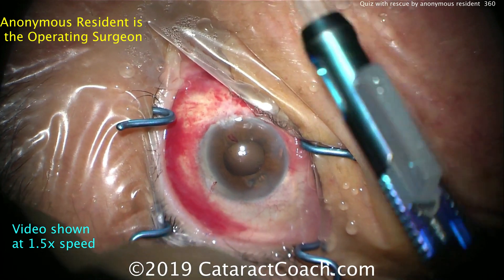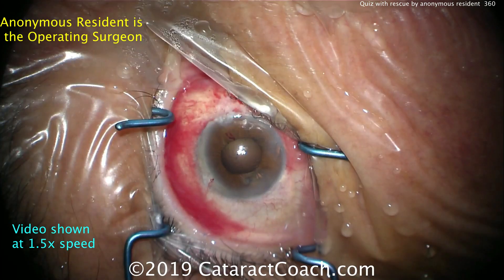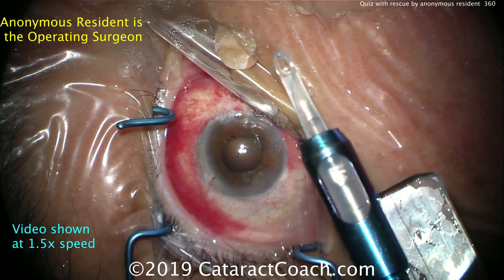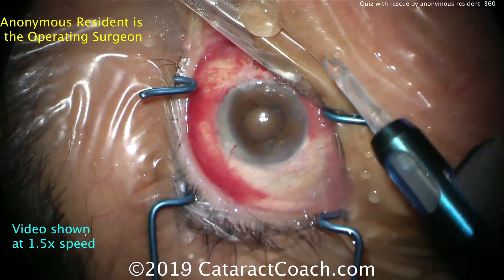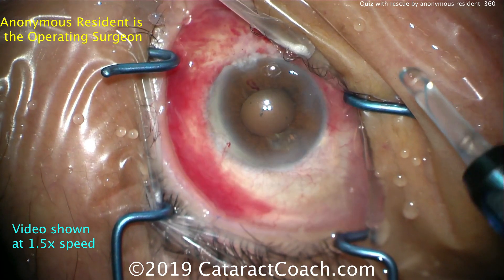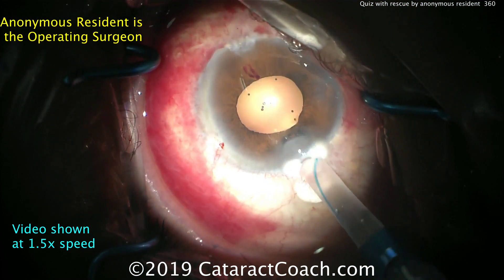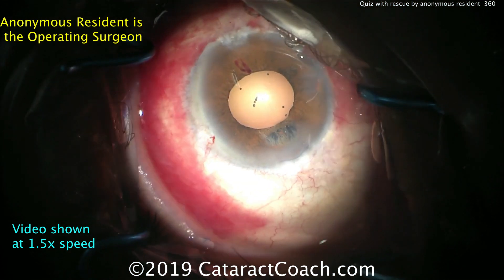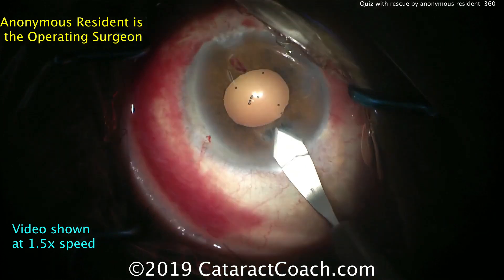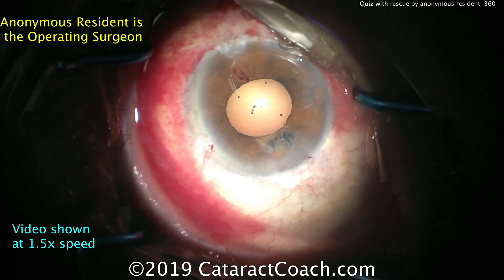Now we're going to zoom in and get this lens inside the eye. We sped up the video to 1.5x speed just to get through the case a little faster. Zooming back in on the case, there's a little bit of sub-incisional iris atrophy from phaco. There is a good sulcus area that's intact, a good intact capsulorrhexis, and any vitreous has been cleaned up.